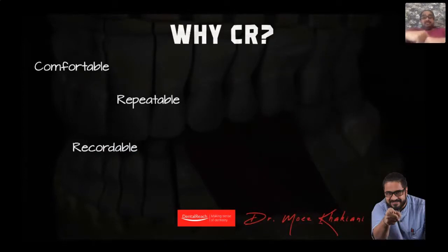And then we arrange the teeth in CR so that MIP and CR coincide with each other. That's exactly what we need to do in tooth supported full mouths. We record CR, but instead of setting acrylic teeth in, we do a wax up. A wax up which makes MIP the same as CR. So the concept does not change.